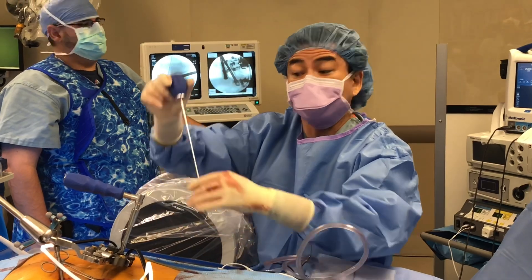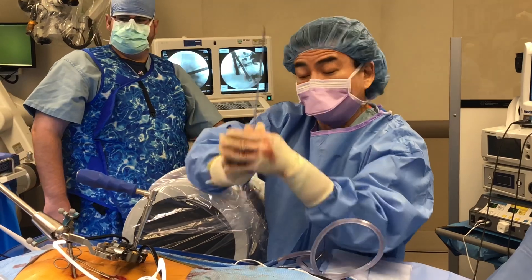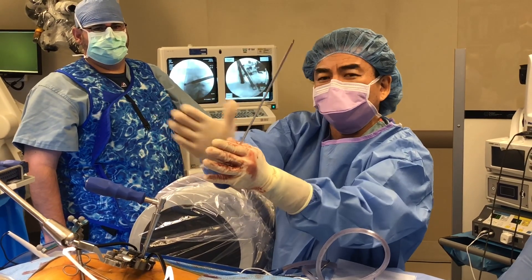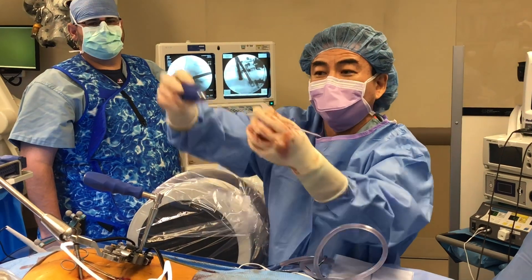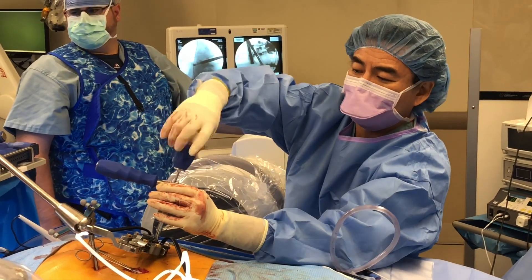We have the interbody implant, also known as the cage, in. It's one of those cages that expand — it will go in small and by turning a handle, it will get bigger and bigger until it fits the disk space perfectly. We use this driver to accomplish that, and just by turning it, it will get bigger.